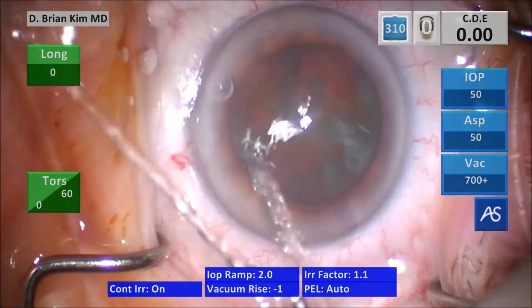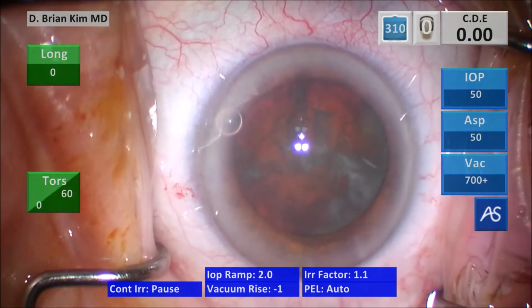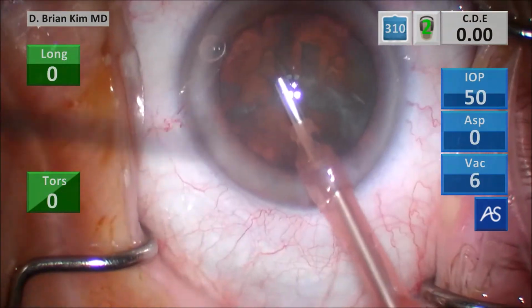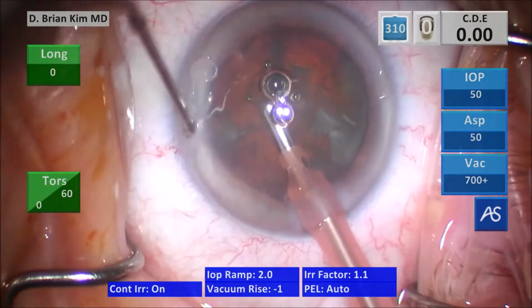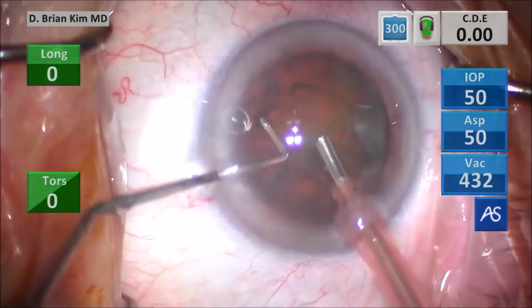Irrigate the surface of the eye. I'm turning the sleeve so I get a little bit more exposure with these dense lenses. I lift the incision with the chopper, go in with irrigation off to minimize Descemet's trauma. Remove the surface epinuclear material, which is minimal here.